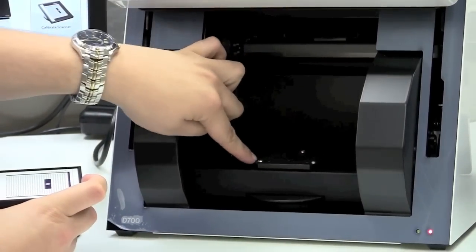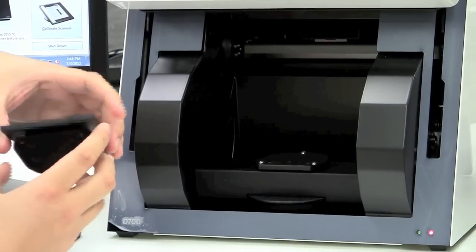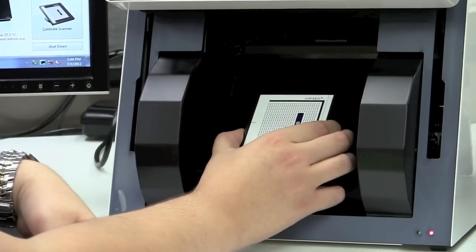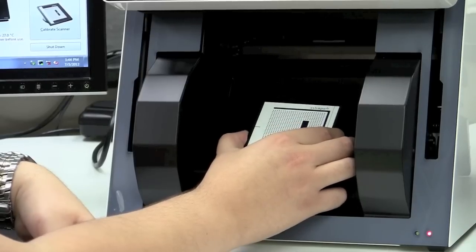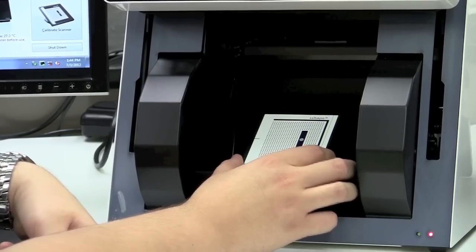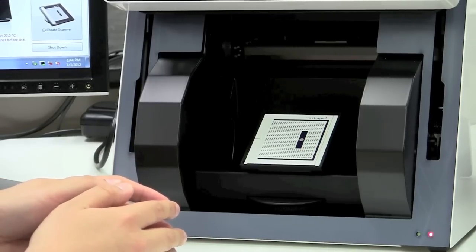These three grooves correspond with three spots inside the scanner itself — one in the back and then two in the front. This is magnetically held in place. As we place the calibration object inside the scanner, it only goes in one way, and the calibration item should be facing out towards you. As you place it in, you'll feel the magnetic pull and you should feel the calibration item snap securely in place.